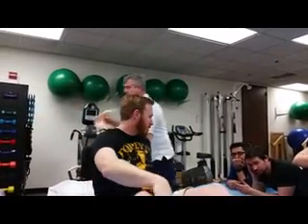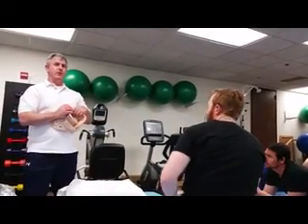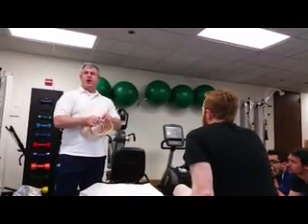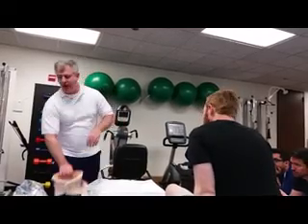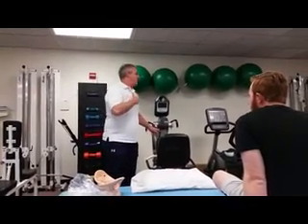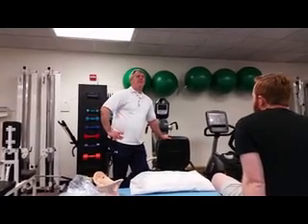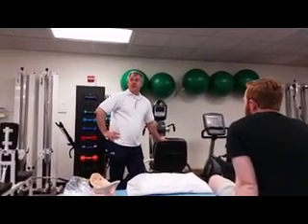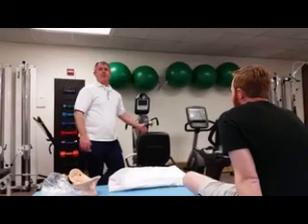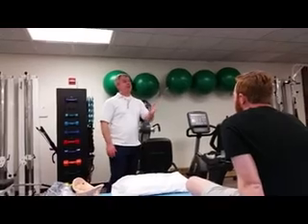The other thing is, when are we most likely going to be using this, or when are we going to see the patient taking this? Fracture. A fracture, but what setting? Car accident. Acute. Whiplash. So they're in the hospital. What is the patient going to have in their room that might help them or help us put the thing on? A mirror. Inclined. Hospital bed. Nurse. Of course. The more they sit up in the bed with the incline at the head of the bed coming up, the easier it is to put on.